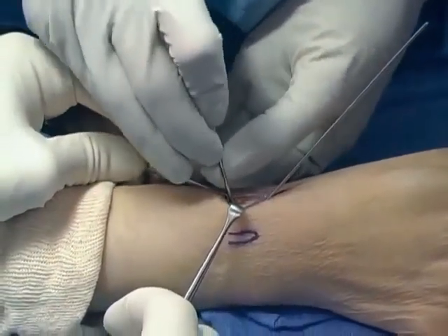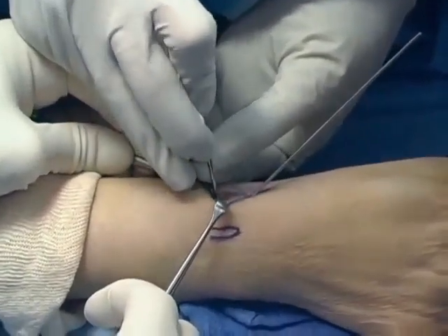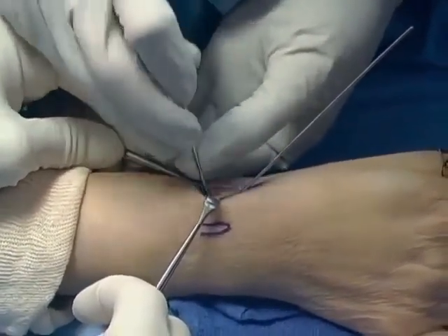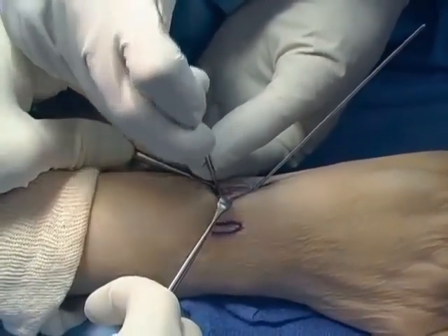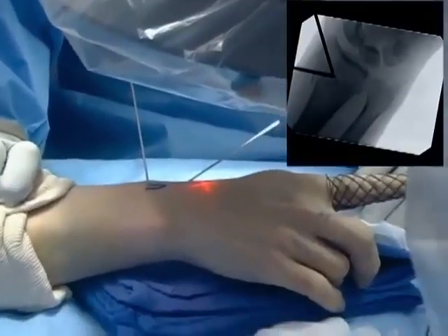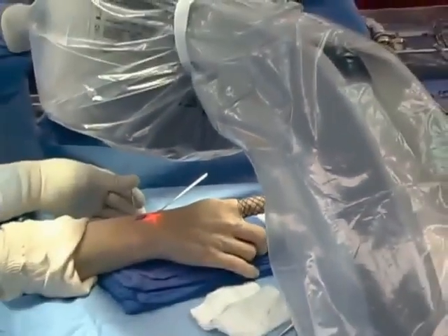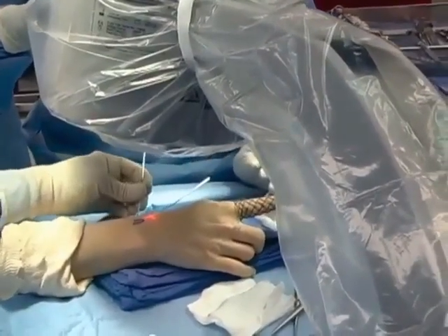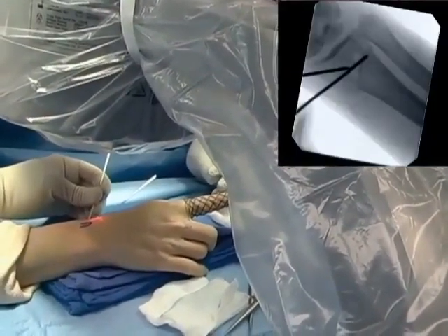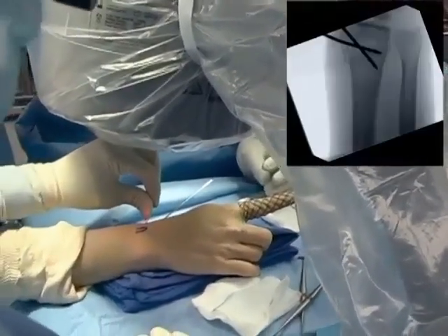You can see it is placed from proximal to distal and will be used as a lever to translate the fracture fragment ulnarly, improving the reduction. Here the position is checked and at least some of that radial translation has been corrected. The fracture is further levered ulnarly and a nearly good correction is obtained.